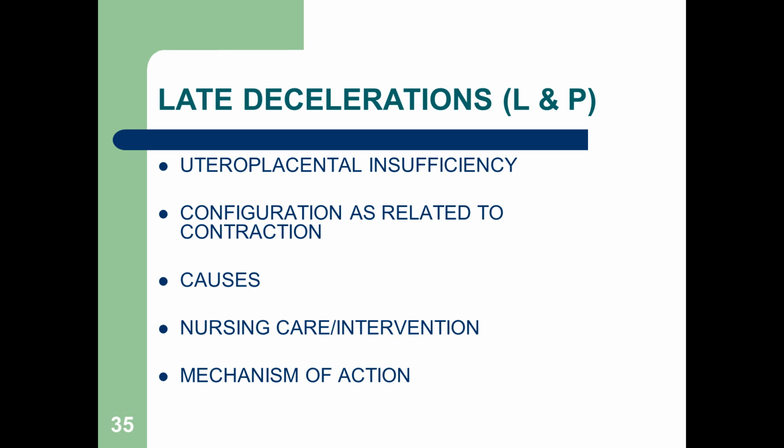Late decels require prompt intervention, okay? The base variability is of utmost importance. The object of intervention with a late decel is to maintain oxygenation while assessing and eliminating the stressors. Nursing care: change position, elevate the head of the bed, give them O2, increase their fluids, stop the pit until the fetal heart rate returns to normal, and then only if your doctor tells you to, okay?